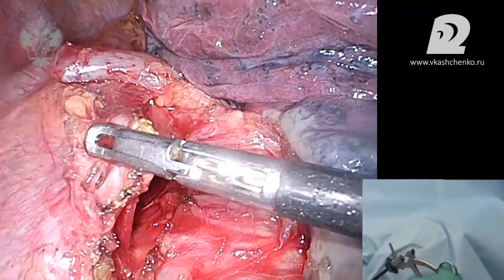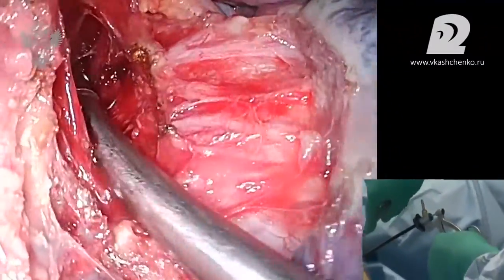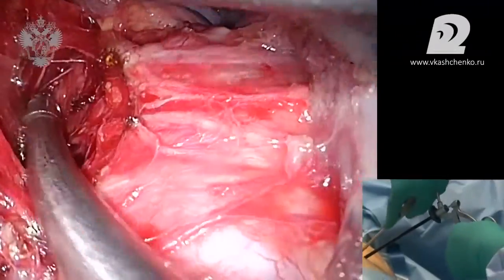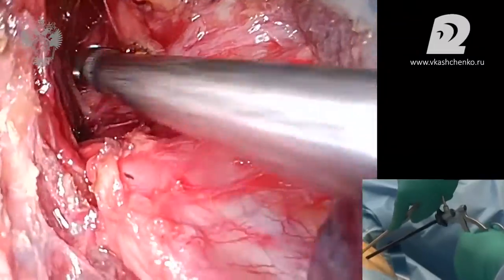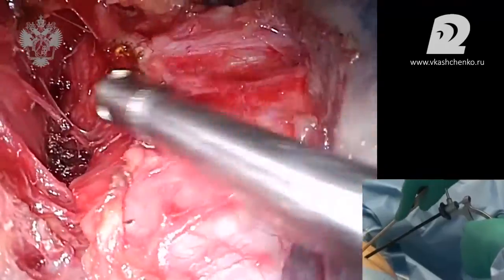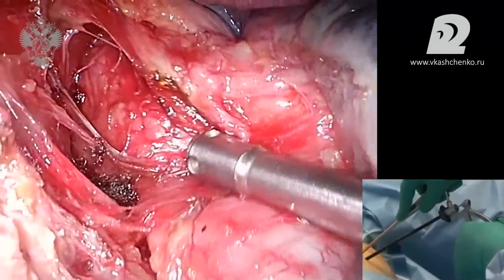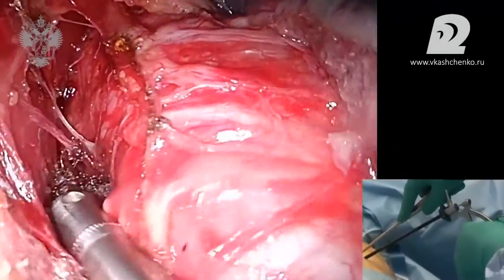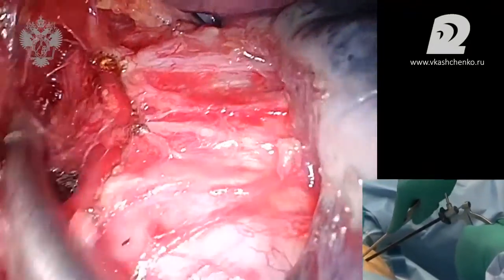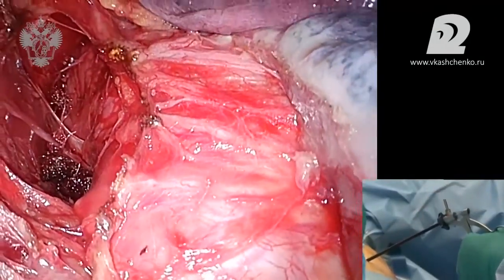So we have a question from the audience, from the floor. Judging by the picture, it's a left approach, and what about the prone position? Prone position is very good. In fact, it allows you to solve 99% of all the questions and issues, and the dissection being one of them. Now you can see the main bronchus and the bifurcation area. This is the right, and this is the left main bronchus. Now I'm going to come back to this prone position a bit later.